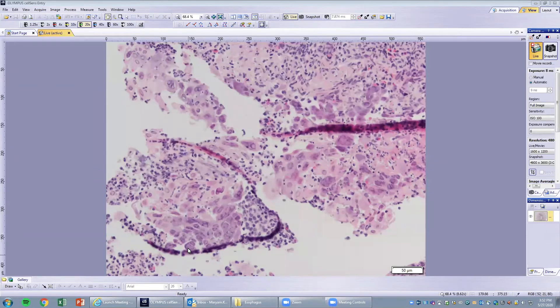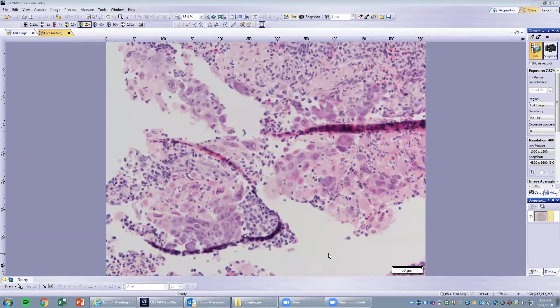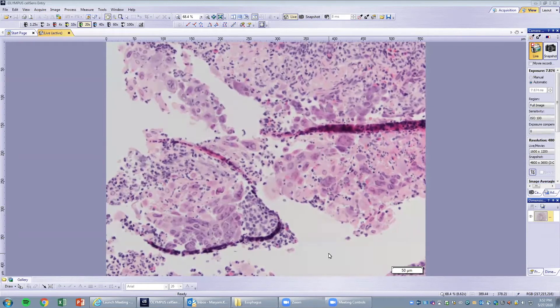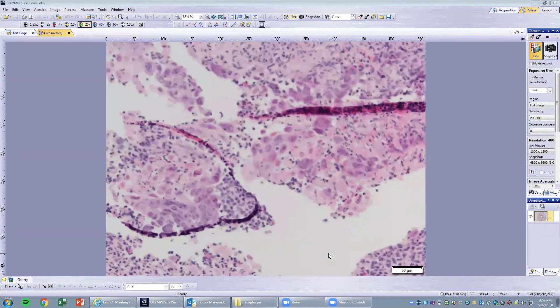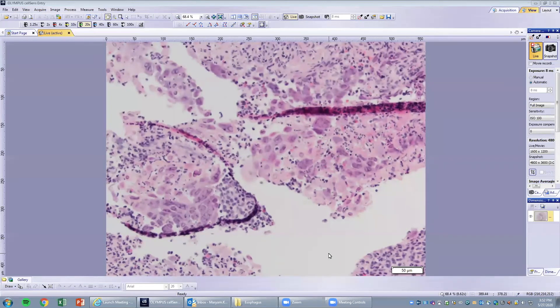The three M's: multiple nuclei, molding of them together, and margination of chromatin. This is the hallmark of HSV esophagitis. Often these patients are immunosuppressed and present with an ulcer, and we see these findings. If there is a question of HSV esophagitis, we can always perform an immunostain.